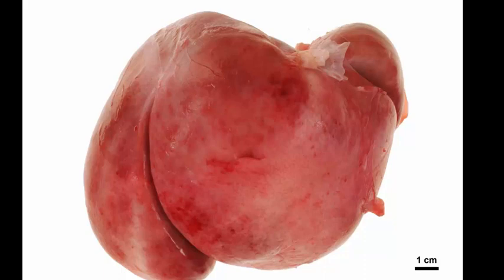Amyloid. There are two things that you're going to see that really cause an increase in the size of a liver in a rhesus macaque. One is amyloid, and the other one is lipidosis. This one doesn't have the orange-yellow appearance of lipidosis, and it looks hard. If you take a liver from a monkey with amyloid and you whack somebody over the back of the head, you're going to knock them out. If you do one with lipid, you're just going to make a greasy spot in their hair, and they're going to be very upset with you. Then you're going to have to run away.